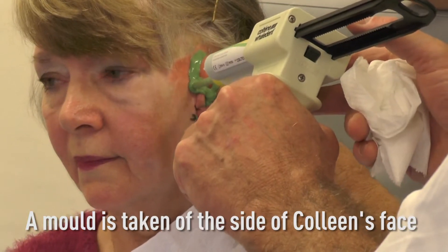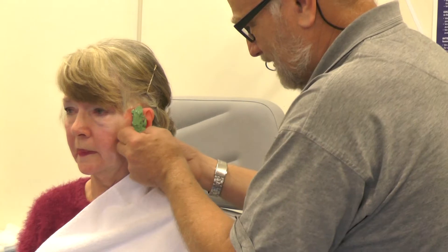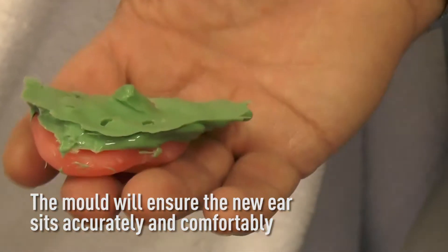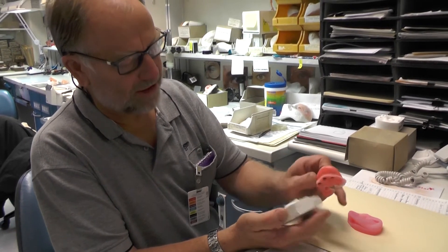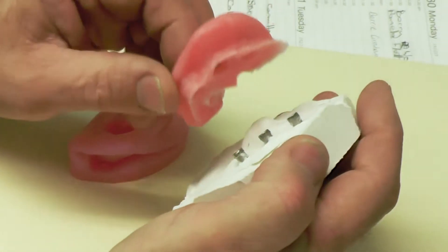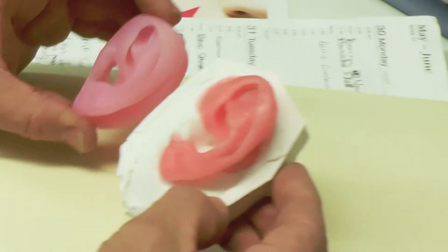I'm looking forward to being back to normal again. So next time, we'll get you up here and we'll have a proper pattern to try. So this is the wax-up of Colleen's ear. She's got the magnets built into it from the impression we took last week, which indexes the wax pattern. Hopefully this will be pretty close to the final size, shape, and location that we require — and that's what we're going to confirm today with Colleen.